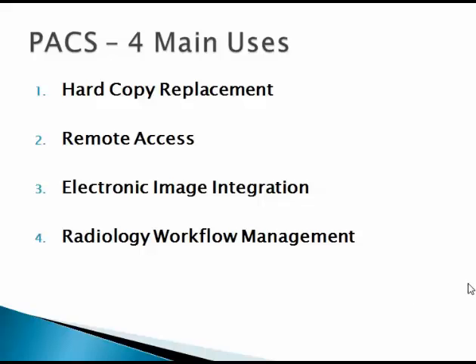So what are some of the main uses of a PACS? We'll get into each of these separately, but on a high level, it's a hard copy replacement, as I mentioned with the x-rays. No more need to carry around those x-rays or have a file room filled with them. Now they're all going to be digitized.